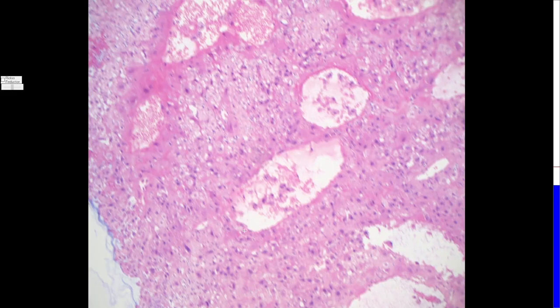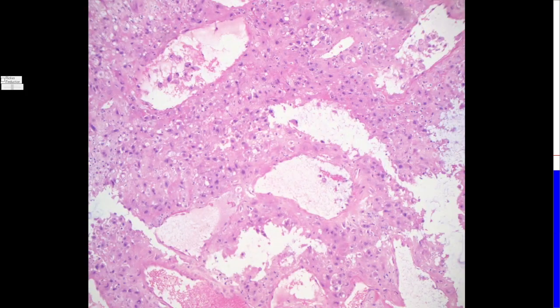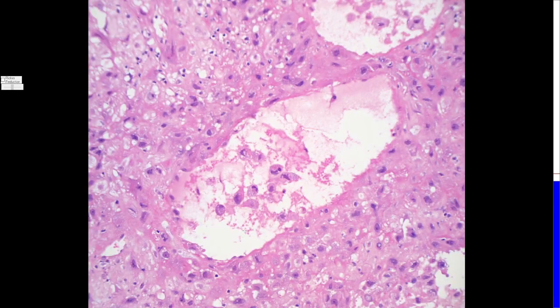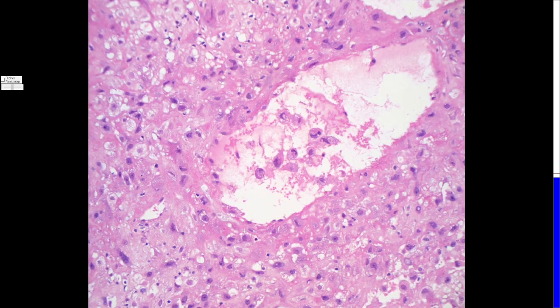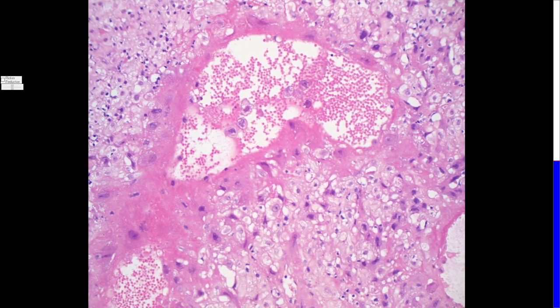Believe it or not, those are also the same vessels, the arterioles, but now they're being modified for pregnancy, and that's achieved by invasion of the vascular wall by these endovascular extravillous trophoblastic cells. They invade the wall, they destroy the muscle, they replace the muscular wall with fibrin, fibrinoid.